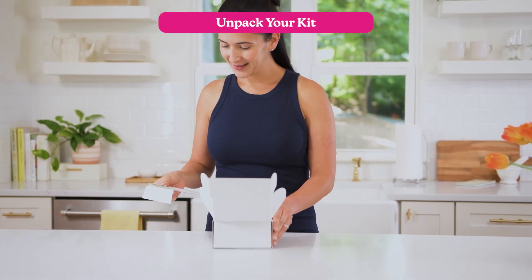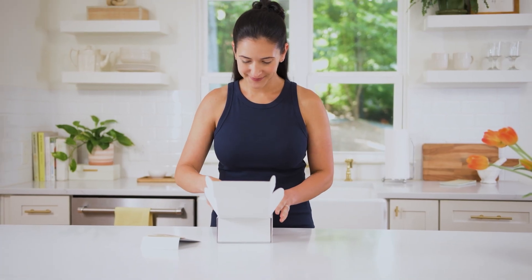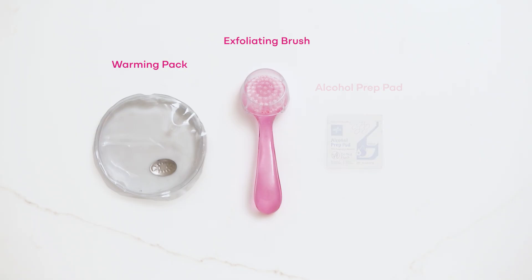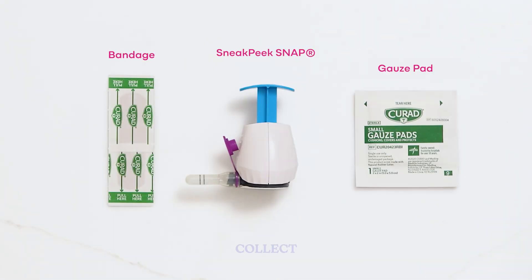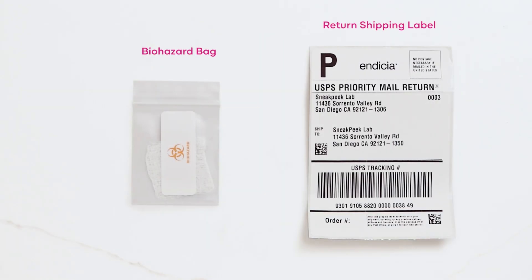Place the contents of your kit on the clean surface. Inside, you'll find an exfoliating brush, a warming pack, and an alcohol prep pad — you'll use these first to prep the collection area. You'll also find the Sneak Peek Snap, a gauze pad, and a bandage for collecting your sample, as well as a small biohazard bag and a return shipping label for packaging and sending your sample.